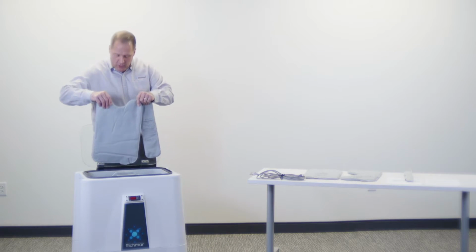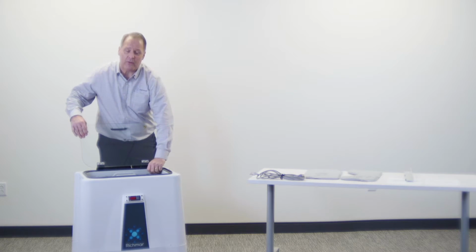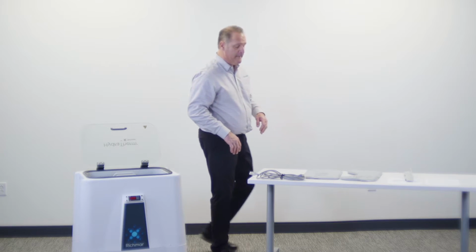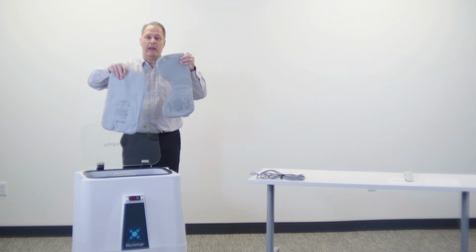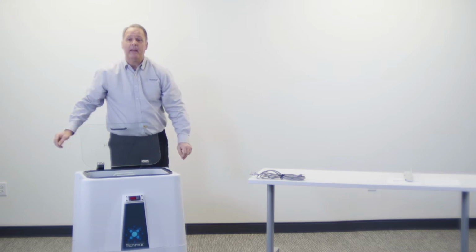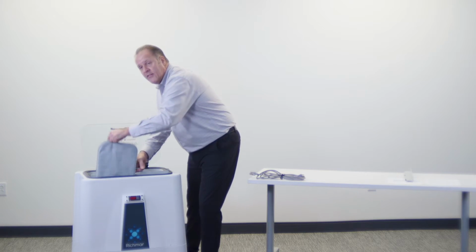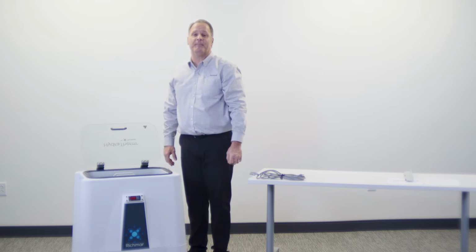What I do is I marry the oversized with the universal pack, and you'll notice how easy those slide into locations. So my back three slots will have all the oversized and all universals. In slots 1 through 3, I will marry one cervical with one standard, and you'll notice how easily these slide into place. Again, the idea is that the top of the pack will be at the water line. We'll be able to pull it out without having to use tongs, and they'll slide back in.